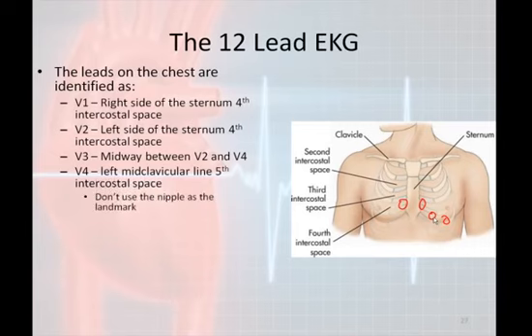Please do not use the nipple as a landmark, and the reason for this is because not all nipples on the human body are placed in the exact same spot. Older people are going to have different nipple locations than younger people, and if women have any kind of breast augmentation done, then the nipples can pretty much end up in any direction. So please do not use tissue as a landmark. Use the clavicle, the midclavicular line, as the actual landmark.